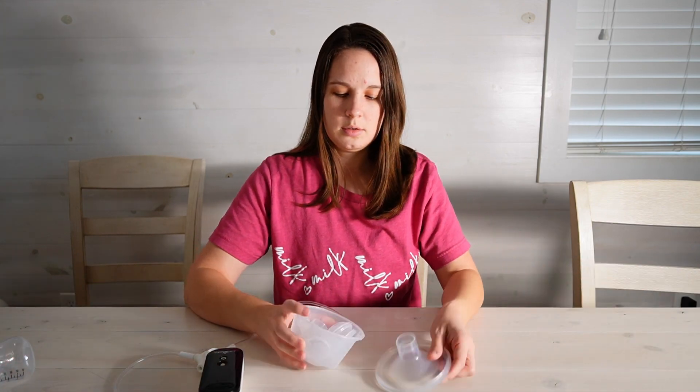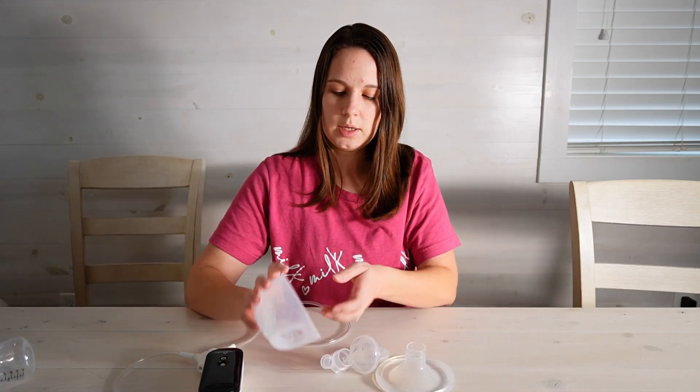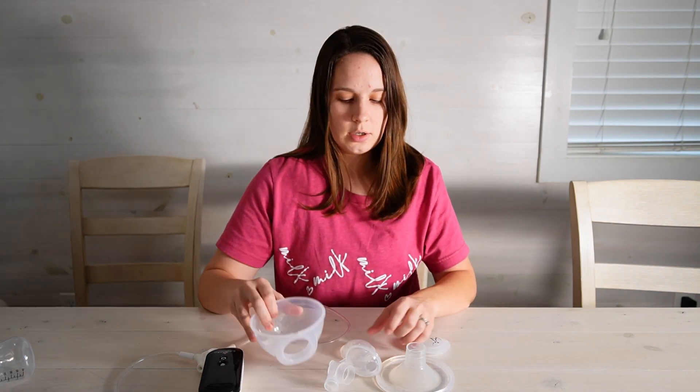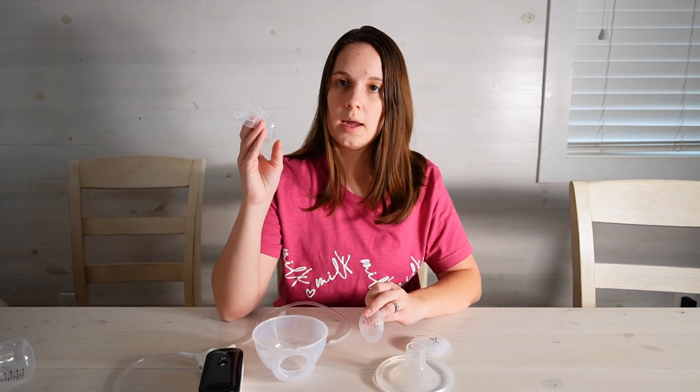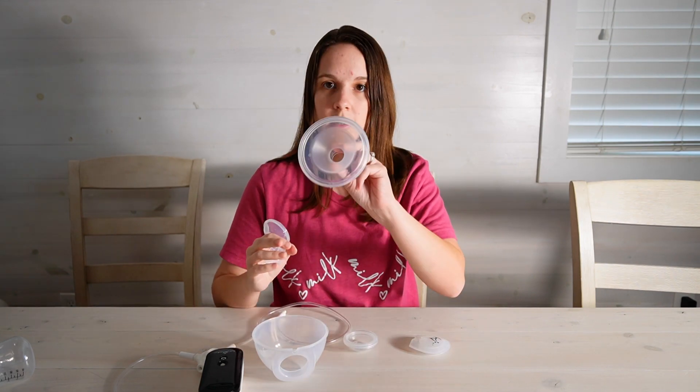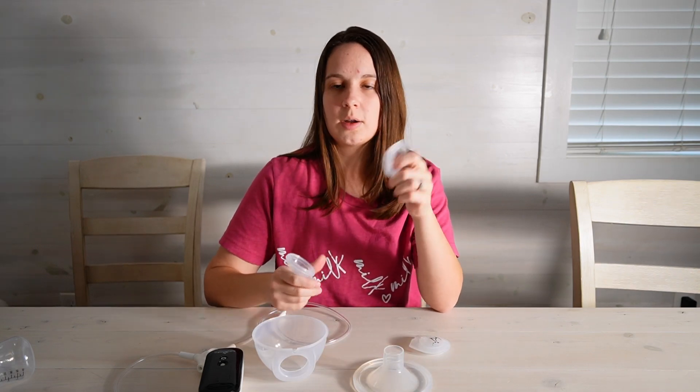Now for the cups — you've got your cup here, the connecting base that just kind of houses everything, your flange, backflow protector, and duckbill.